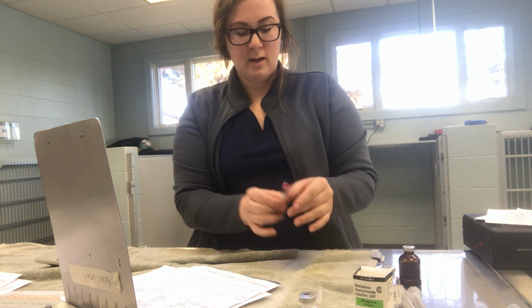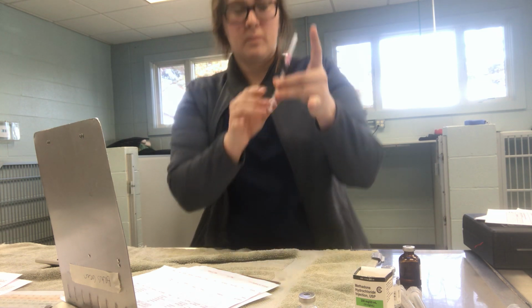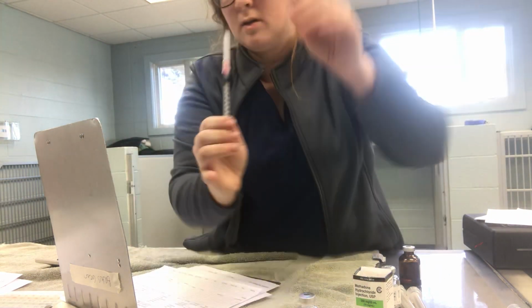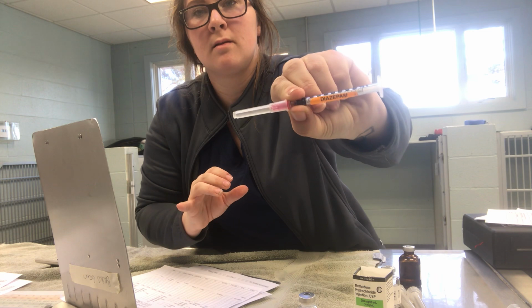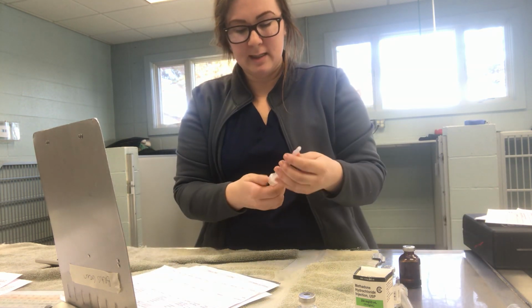Again, one-handed recapping. Okay, so you can see that again, it's 0.08 mLs. We're going to put the diazepam sticker on it. See that? And then the propofol, which is going to be 0.88 mLs.